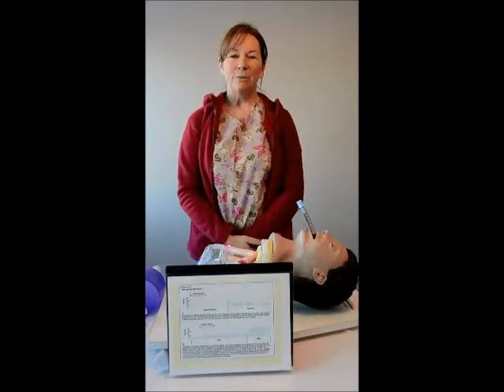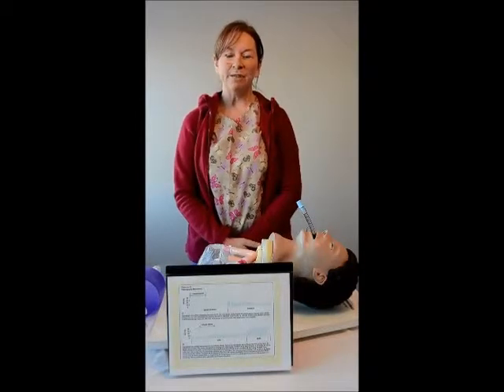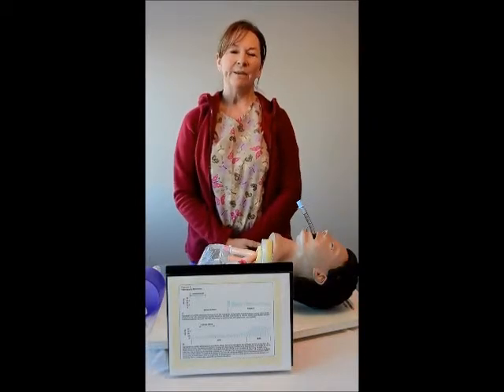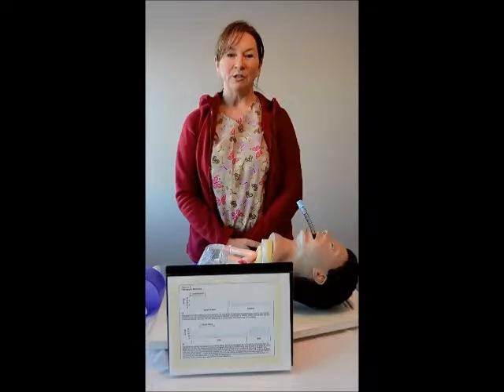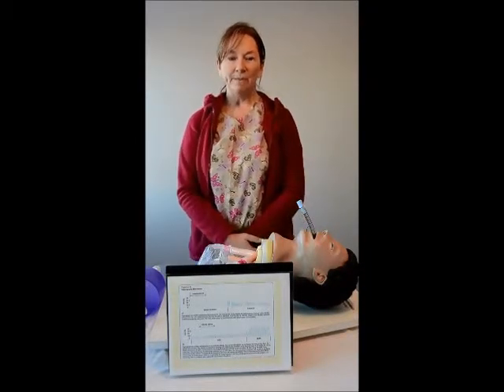In this video, we will be discussing the role of continuous waveform capnography, which has become standard guideline therapy for the 2010 Heart and Stroke Foundation protocol of airway management with an advanced airway. We have the endotracheal tube in the patient.